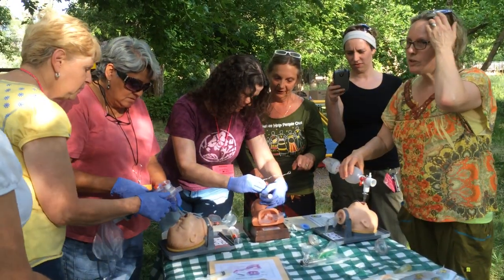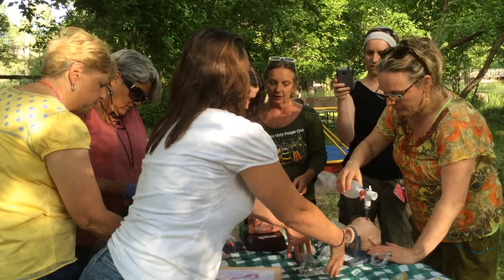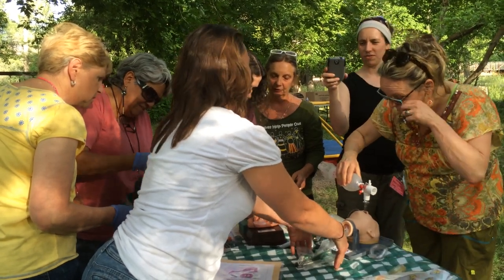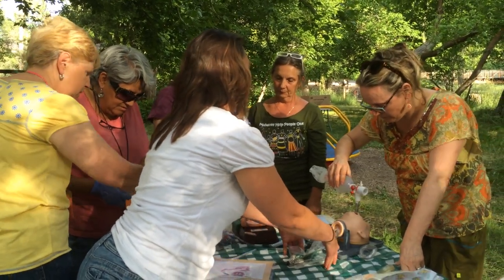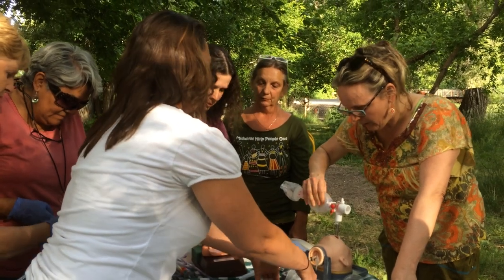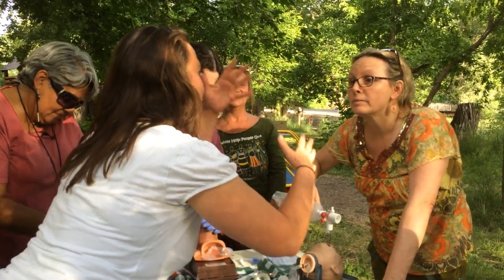So now what? Okay, now you take this out. You let go of this. You pull the stylet rod out. You put your bag mask on. And bag your baby. Okay, 30 seconds. Look at that. That is awesome. Yay.